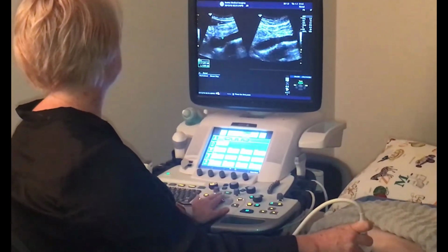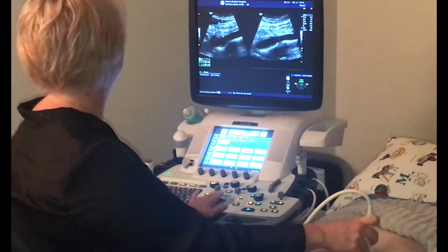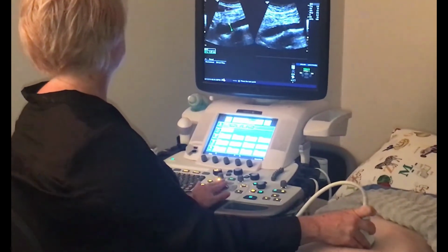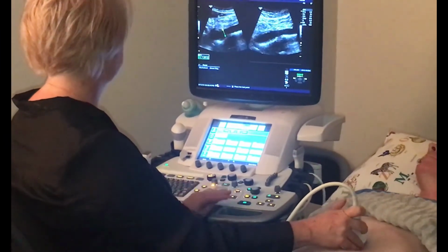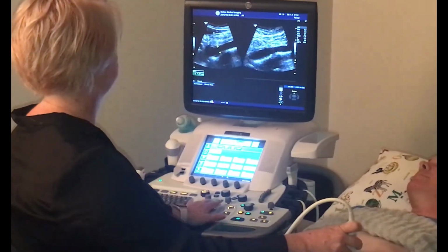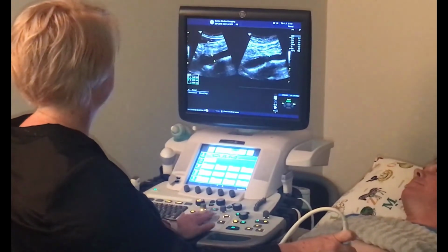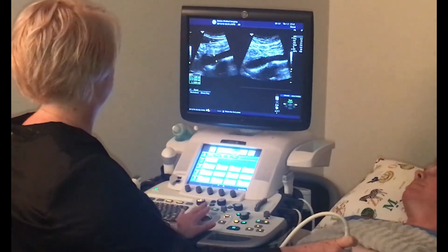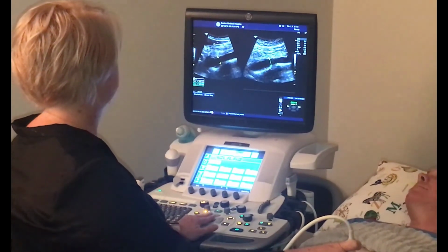You can usually see when you're looking at the aorta whether it looks a bit large, but we need measurements for our worksheets and also to supply for the radiologist. Above 3 centimetres is classed as a AAA, but if a measurement were to be above 5 centimetres, this is a surgical emergency and the sonographer would need to notify the reporting radiologist immediately.